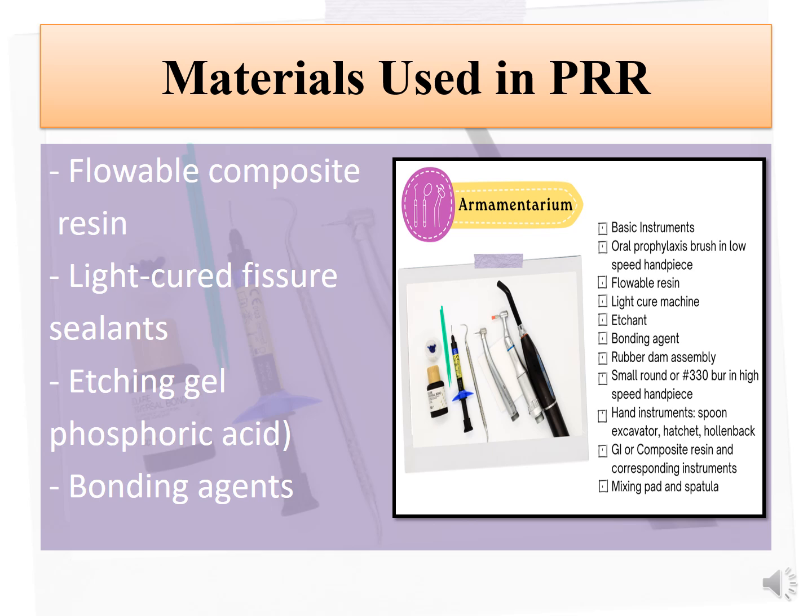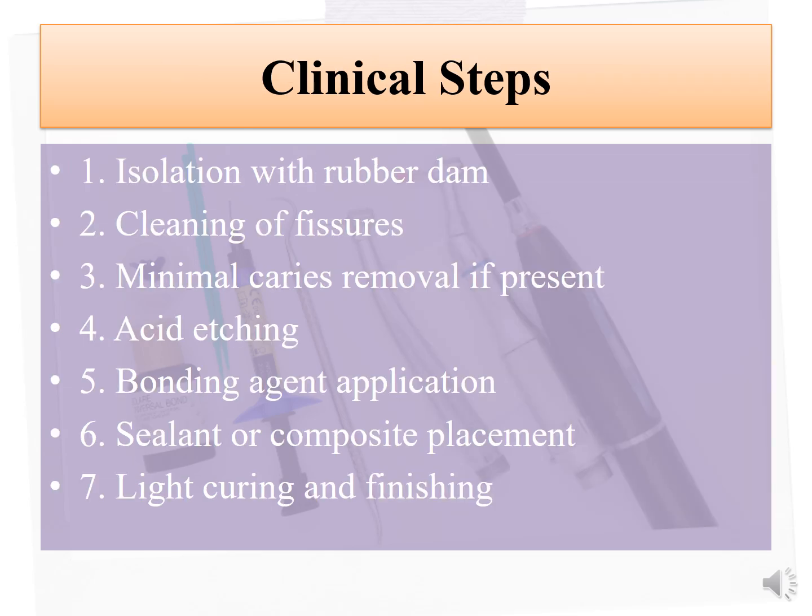Now, let's move on to the steps. Now, let's go step by step through the clinical procedures. Step 1, isolation. The tooth is isolated, often using a rubber dam, to keep it dry and free of saliva contamination.